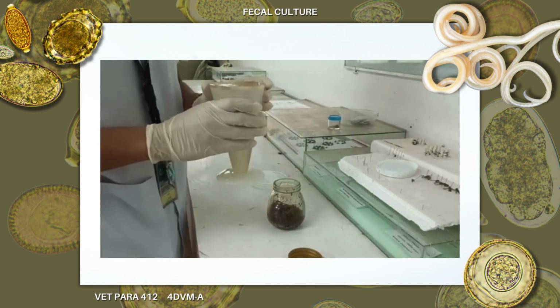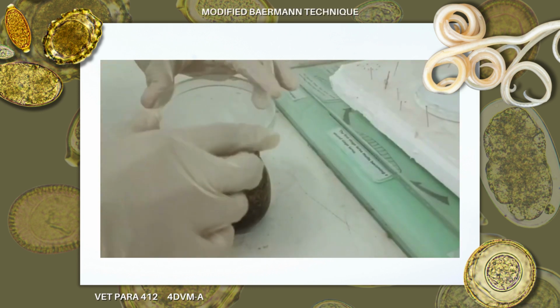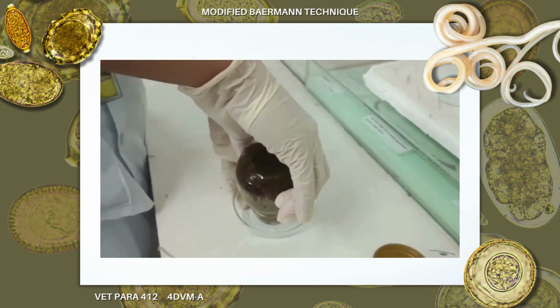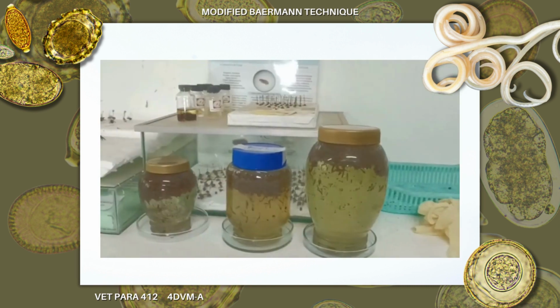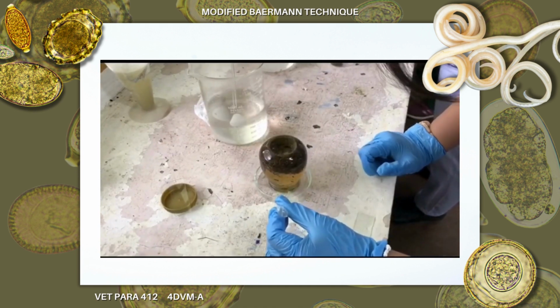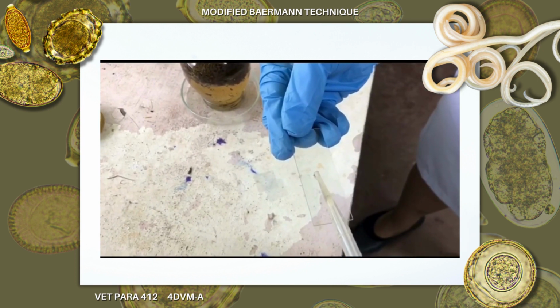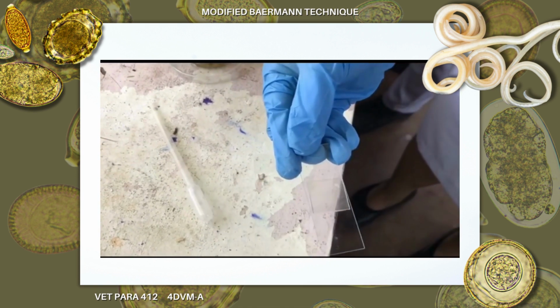Add water to the culture jar to the brim. Invert a petri dish over the mouth of the jar, then turn the jar so that it stands in the petri dish. Pour about 10 to 15 ml of water into the dish and allow the jar and dish to stand overnight. Collect the larvae by pipette the following day from the petri dish. Examine the live larvae, then add a drop of Lugol's iodine, which kills and stains the larvae.